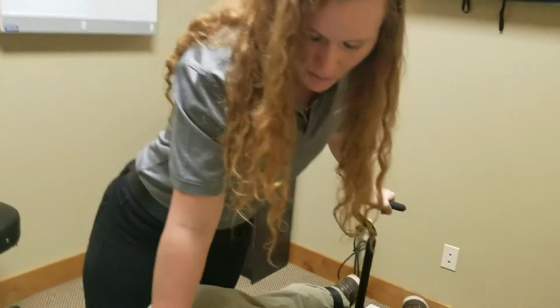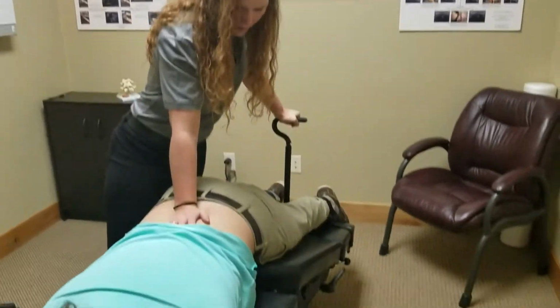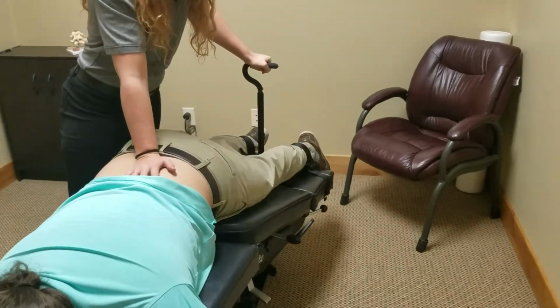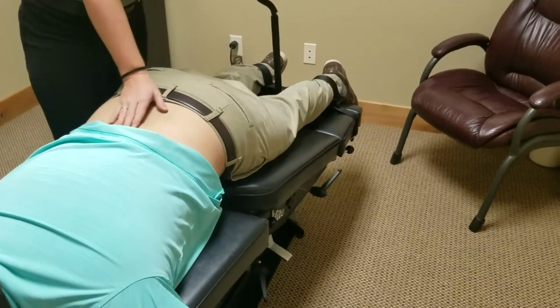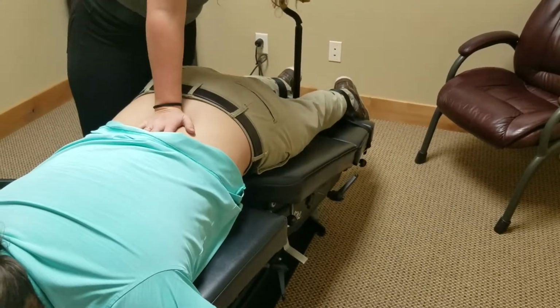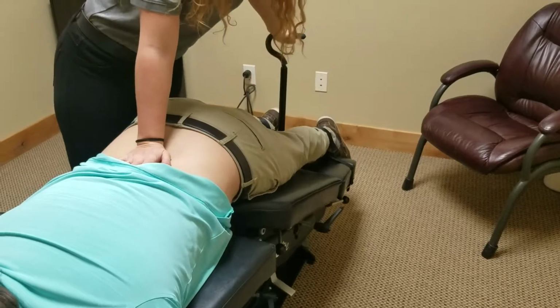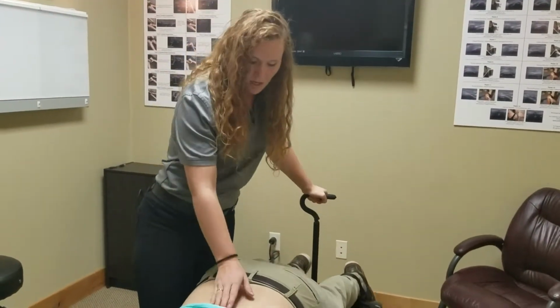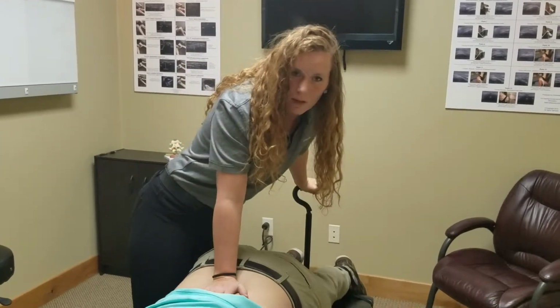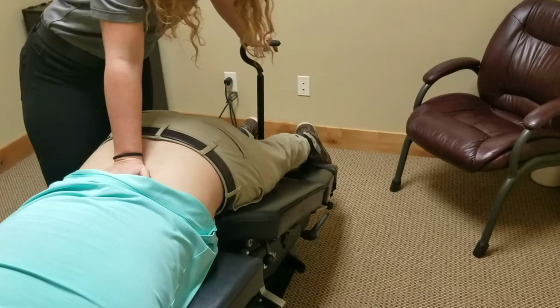Now I can turn the patient from side to side, and you can see that lateral flexion that can happen. If the patient has a disc that herniates out to, say, a certain side, I'm going to open that up the way I need to in order for that disc to kind of suck the nucleus pulposus back into that disc so it's not affecting that nerve in the low back. So this is something that I do with my patients that have disc herniations.